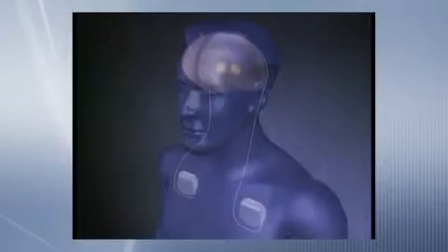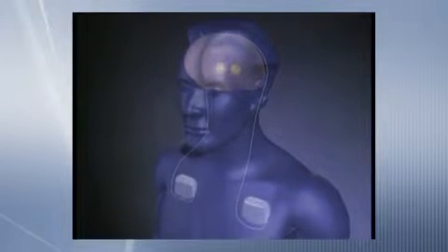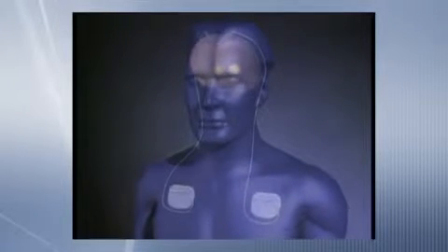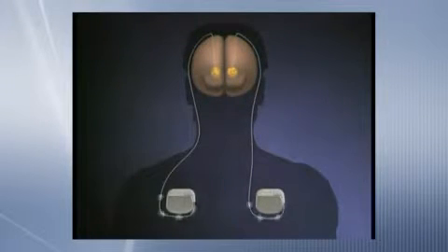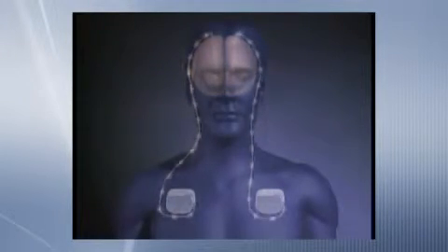Deep brain stimulation is a surgical technique. It's a procedure. What we do is we implant electrodes or wires in the brain in very specific areas, and we use those wires to deliver a very fine electrical current to those regions of the brain in order to reduce the symptoms and the signs of Parkinson's disease and other movement disorders.